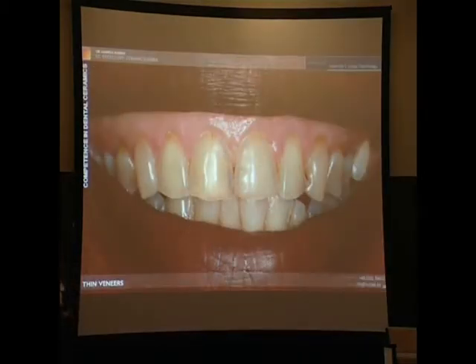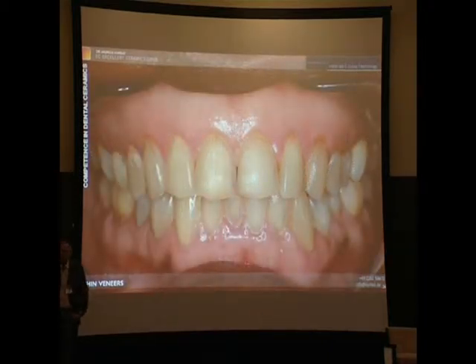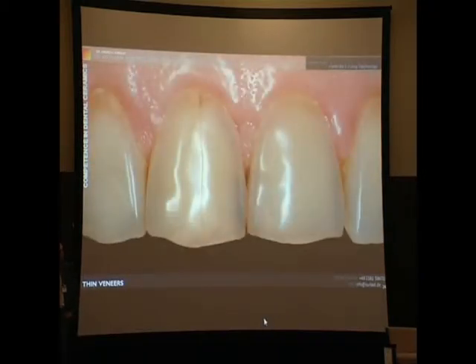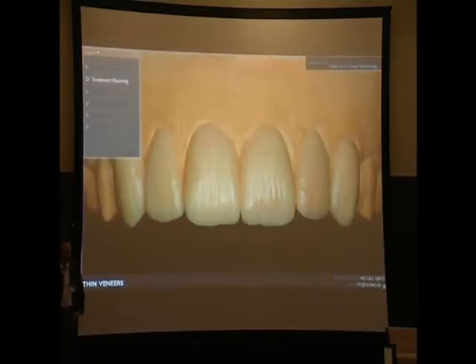This is a lady who comes to our office. She told us, okay, my teeth become shorter and shorter and they don't look very nice. You can see there's an extreme loss of enamel. Only a very thin layer of enamel is on these teeth, on the labial side. Maybe this material is a little bit weaker than the normal enamel. And we made a wax-up for her.